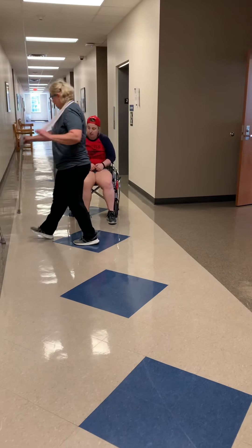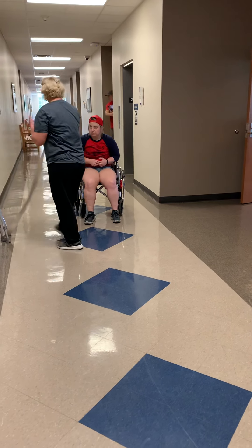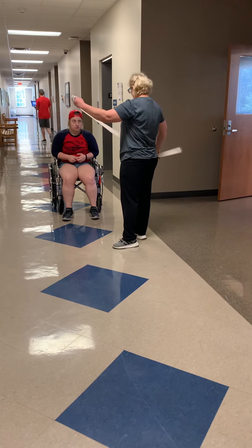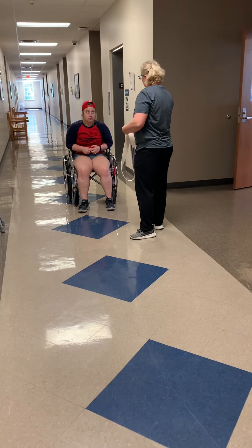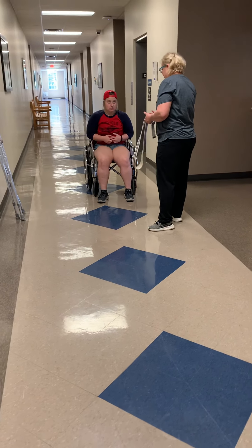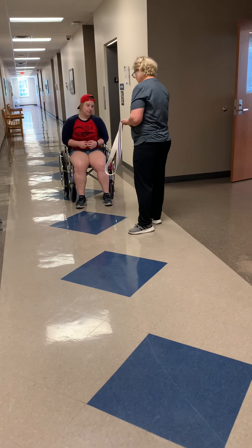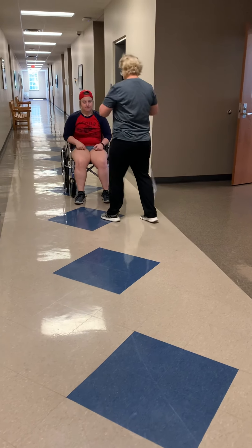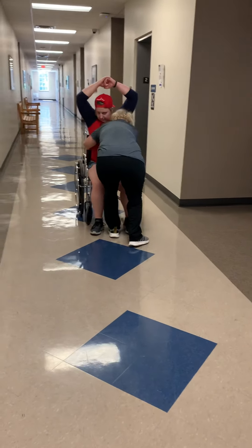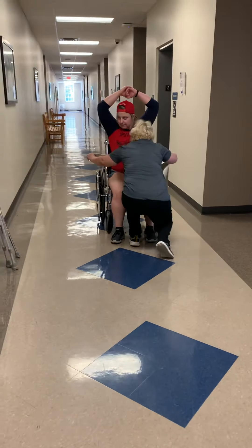Before we get started, I have a gait belt here. This is just for me to hang onto you in case you need me — it's just one of our safety policies. It is going to go around your middle here. Do you have any tubing, piercings, incisions, scars, anything that might irritate you? All right. I'm going to have you lean forward just a little bit for me, and then lock your arms. This might be just a little bit snug until you stand up, and it's just a touch.